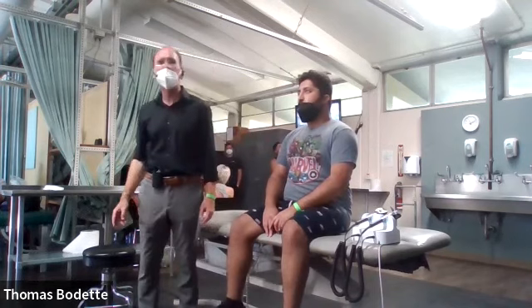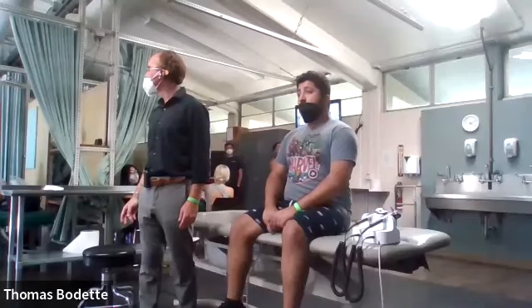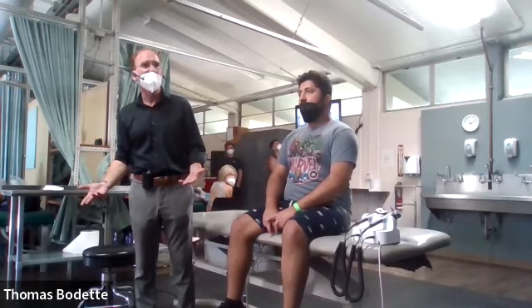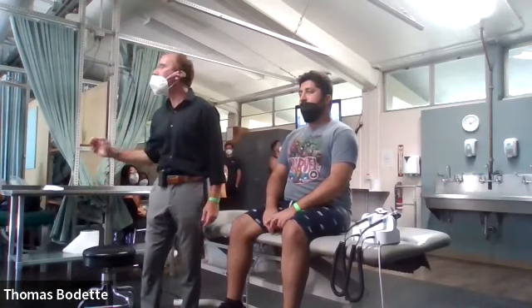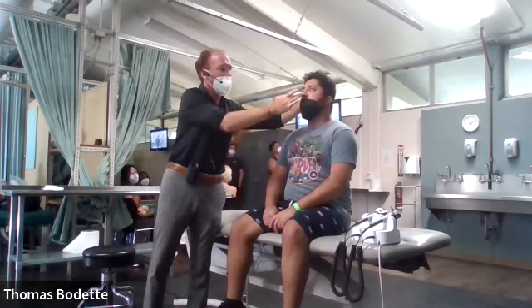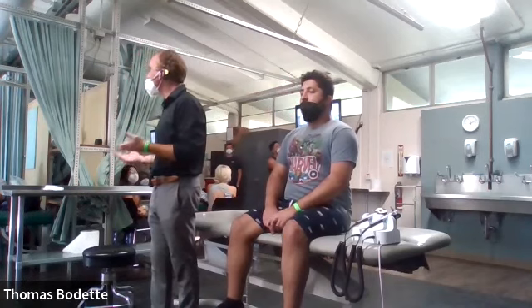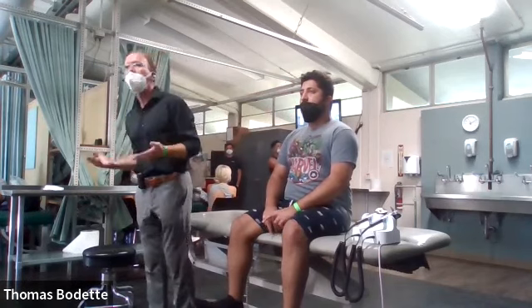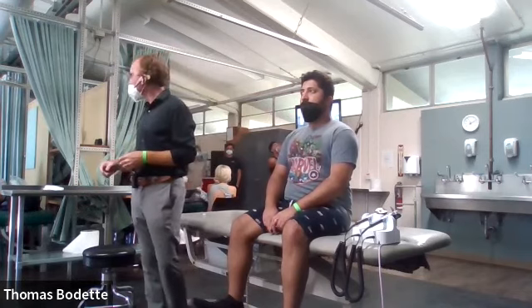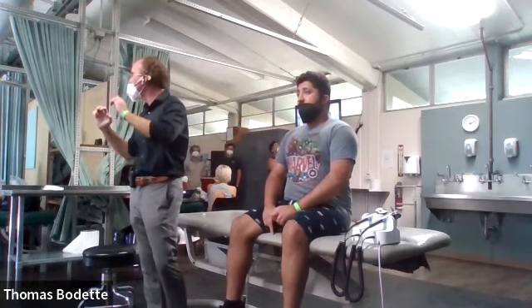Does it matter? Well, I wouldn't ask you to do that if it didn't matter. So the whole point of having the patient's head in extension and pressing the tip of the nose in is to widen the nostrils even further, to make it a little bit less uncomfortable for you to insert the speculum. So head in extension, press the tip of the nose in to widen the nares.